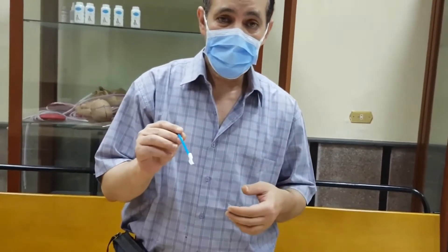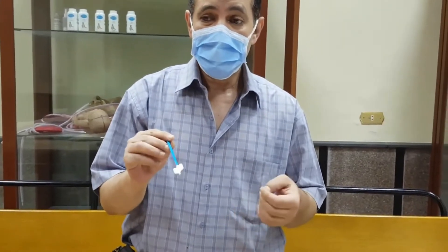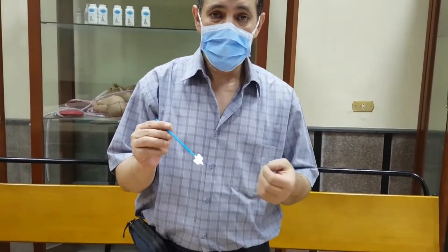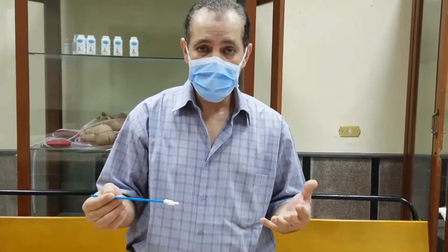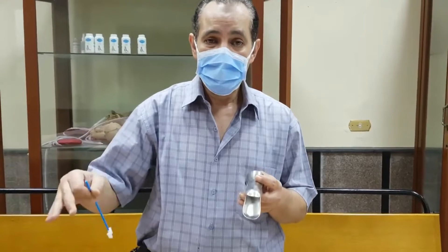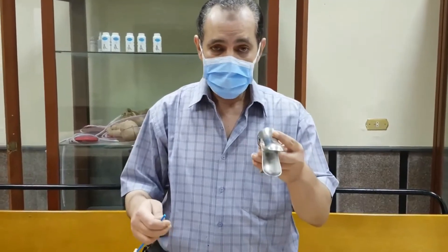What about a smear — cervical smear for cytology — as a screening for cervical carcinoma or CIN? I want to diagnose CIN early so I can manage it properly, and this is one of the important screening programs all over the world. Again, the same precautions as before: no vaginal douche in the previous days, no intercourse, no vaginal suppository, broad-spectrum antibiotic or antifungal. Then I insert the speculum.